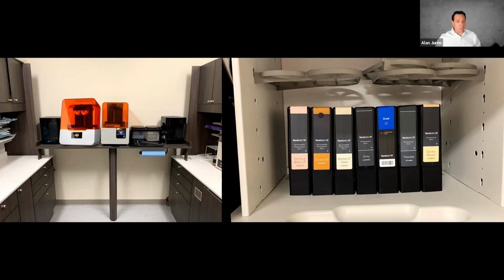So we have denture-base material, we have dental surgical guide, we have dental LT clears, what we use for our splints. We have some more of my hobby materials. We have gray, draft, and flexible resins that we can print in. So I was creating that face mask. I was printing it in a draft material, a cheaper material, and trying it and seeing how it works.